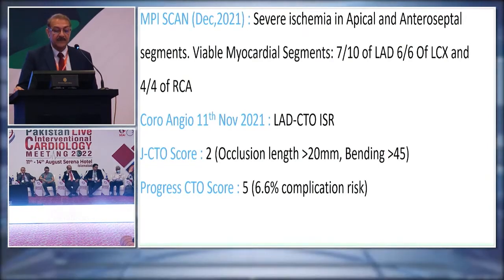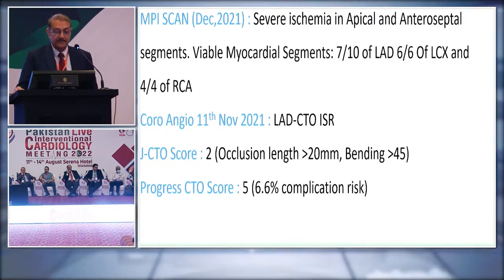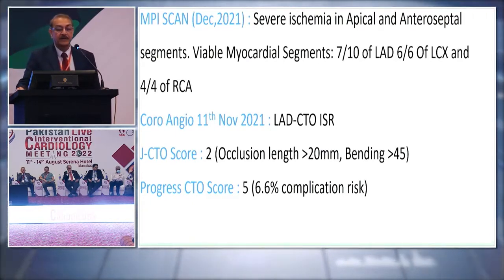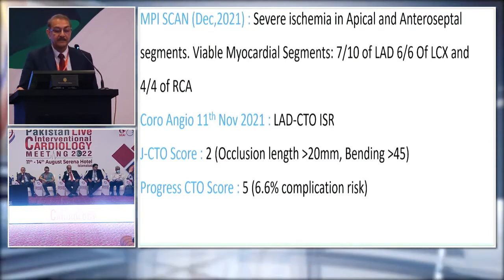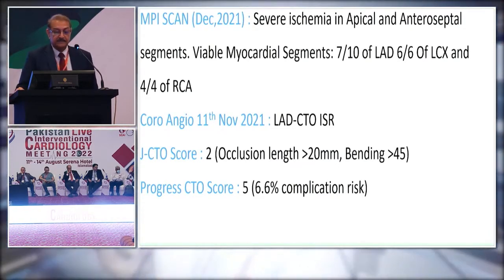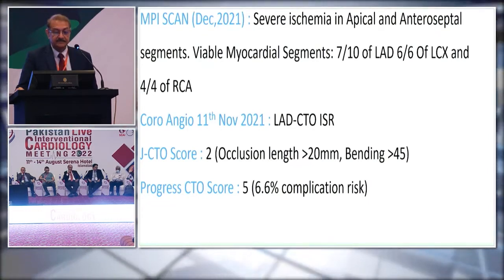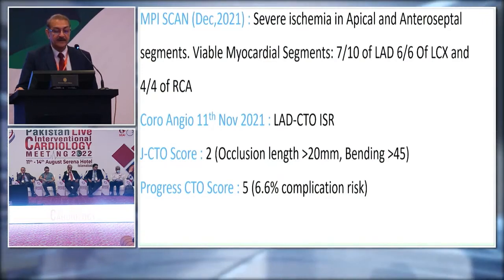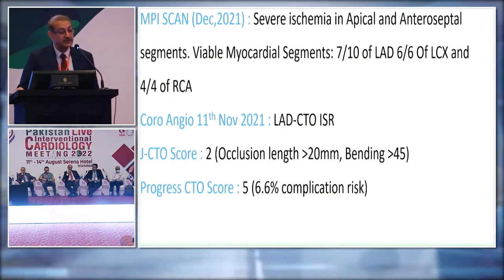All right. So this is Rosli here. Thank you very much for having me. It's an interesting problem, because now we have a stenosis at the ostium, and at the same time it reconstitutes close to the stent where it was placed before. So let's have a picture. Can we play this? Yeah, can I just hold for 1 minute?